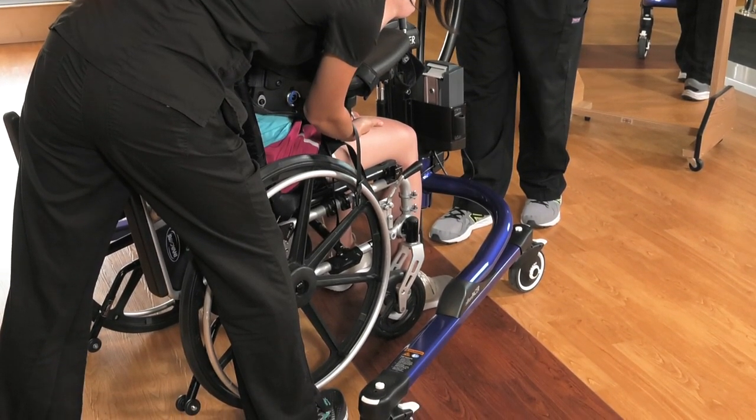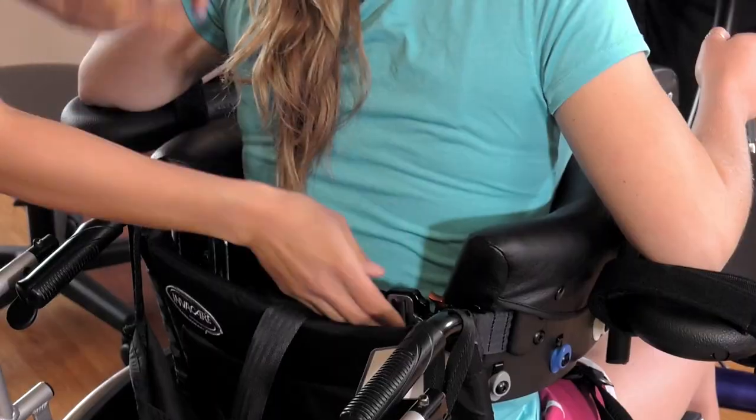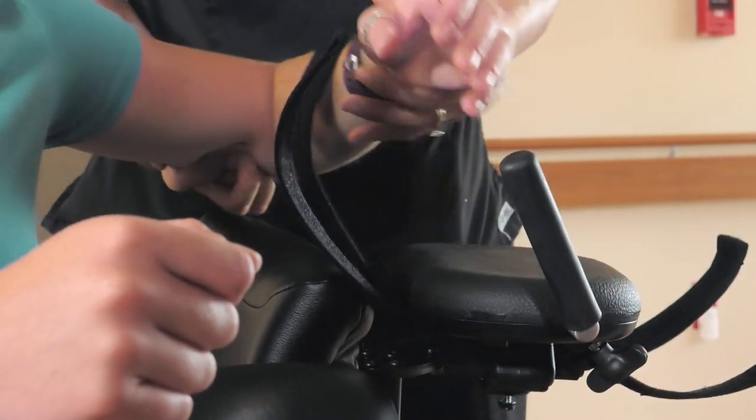Once the patient is secure in the chair, disconnect the pelvic support from the colored clips, release the body support strap, and disengage the patient's arms from the forearm supports.